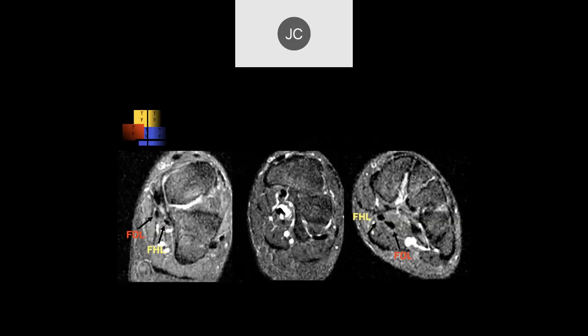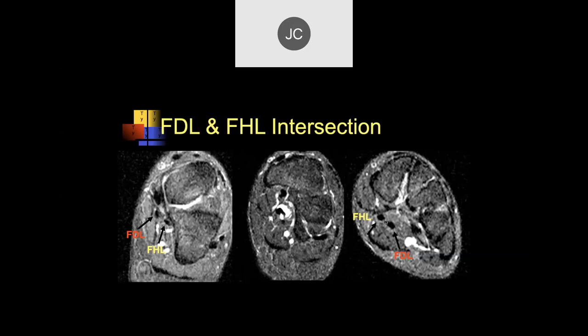Here approximately we have the flexor digitorum longus, flexor hallucis longus, and more the posterior tibialis — the three tendons. Going a bit more distally, at this point the digitorum is medial and the hallucis longus is lateral. Then there's an area where they cross over — the master knot of Henry. Distal to this, the flexor hallucis longus is medial and the flexor digitorum is lateral. In this case, we're seeing a lot of fluid right in this location — this is called intersection syndrome, foot intersection syndrome. The clinical symptom of pain in this location is typically called jogger's foot.